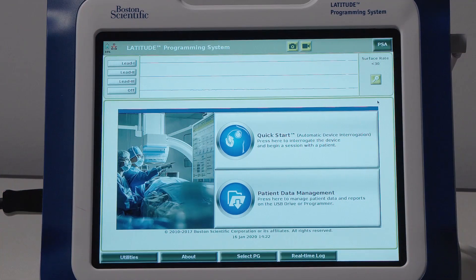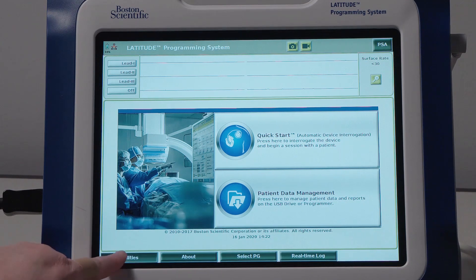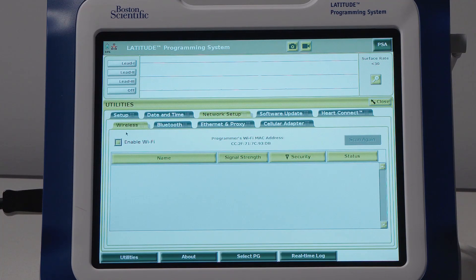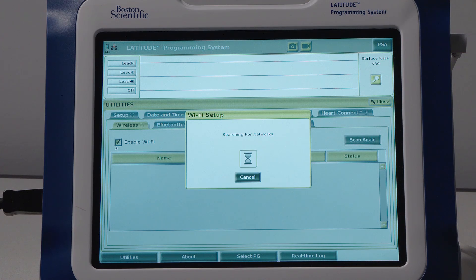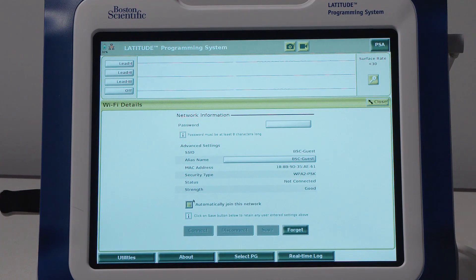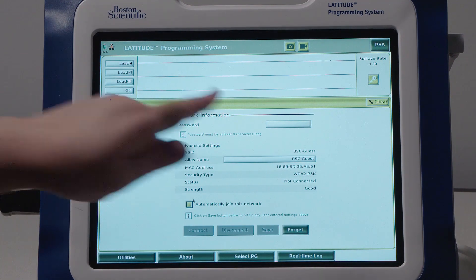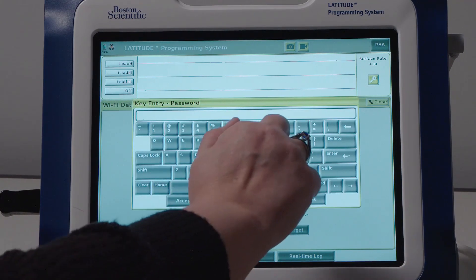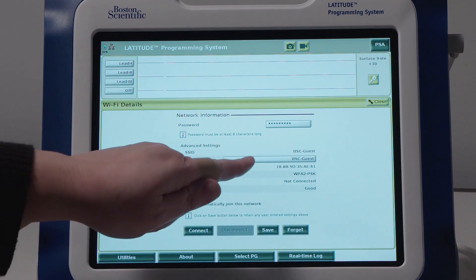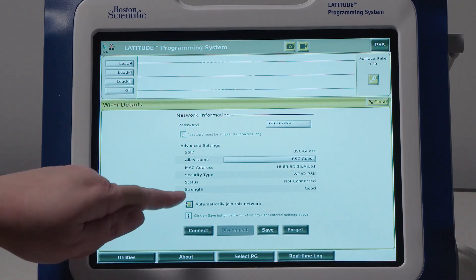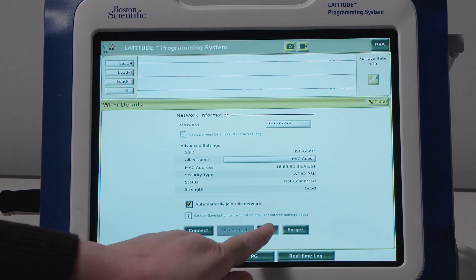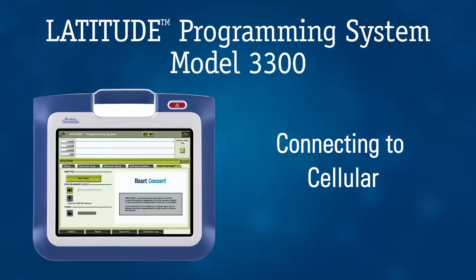Another more portable internet option is Wi-Fi. To enable Wi-Fi, select Utilities, Network Setup, then the Wireless tab and simply check Enable Wi-Fi. The programmer will scan for all available networks. Select the desired network by clicking the Details button to the left of the network name. Within the Details screen, enter the network password for the secure connection. An alias name can also be entered. To connect to this network automatically when it is in range, check the Automatically join this network box. Click Save to remember these settings, and then Connect. Status will reflect once connected.